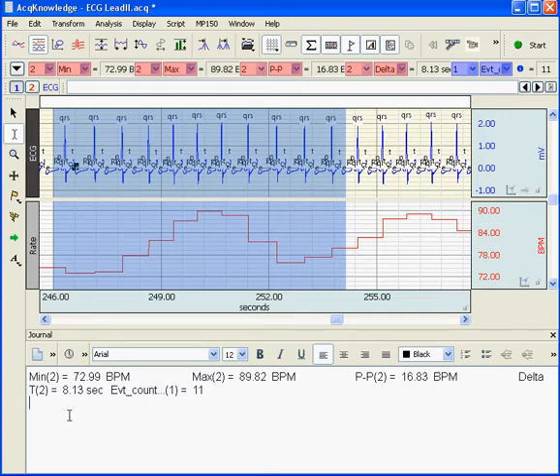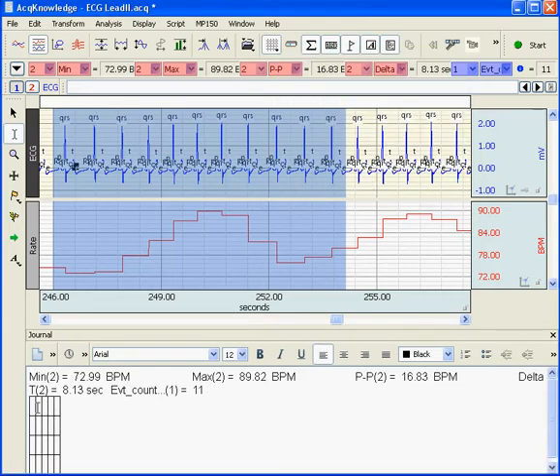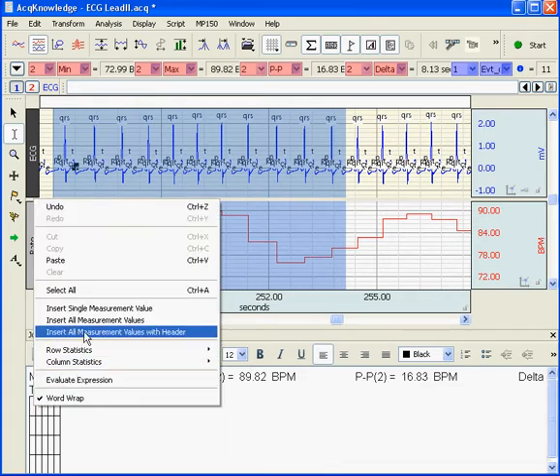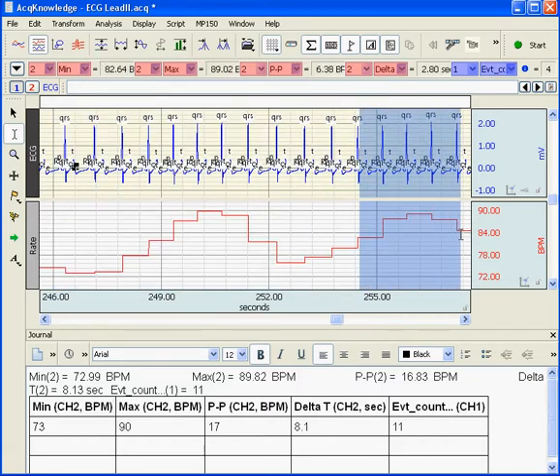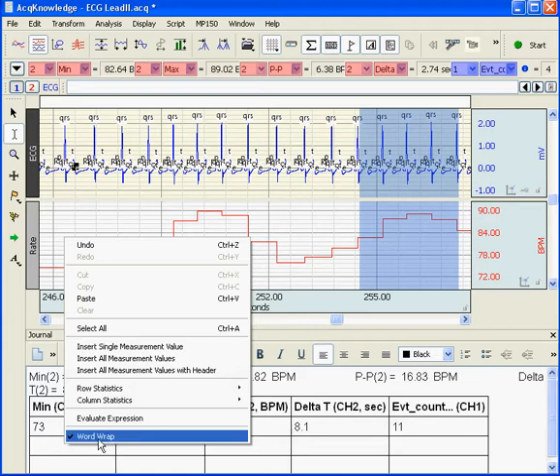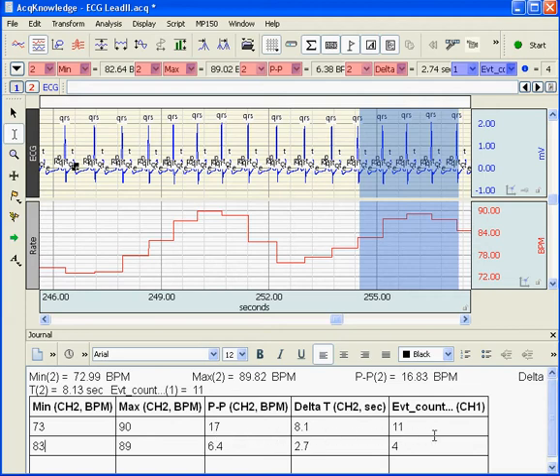Another nice new feature in Acknowledge 4.2 gives us the ability to add a table. I am going to add a table with 4 rows and 5 columns. Now we can see we have got our table down below. By right-clicking with my mouse and selecting Insert All Measurement Values with Header, I have now created a nice little table. I can highlight a little more data, and using my right mouse button, insert all the measurement values — and I have now pasted these measurements down into my journal file.